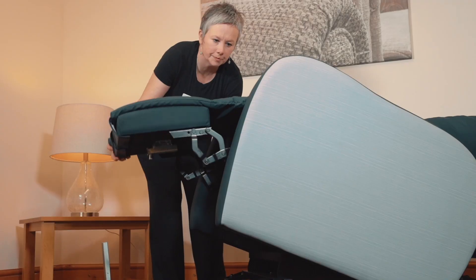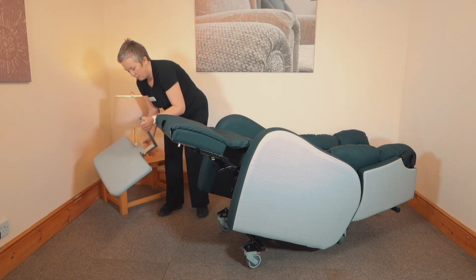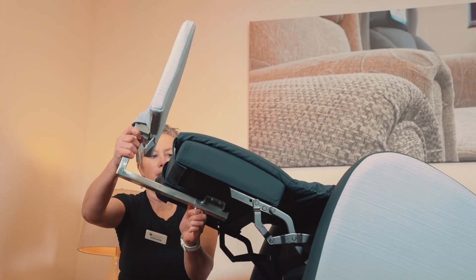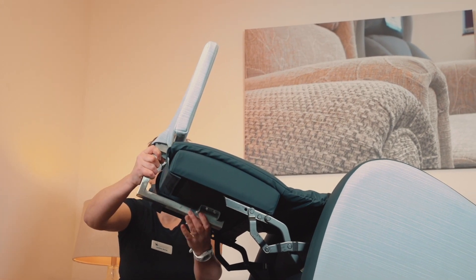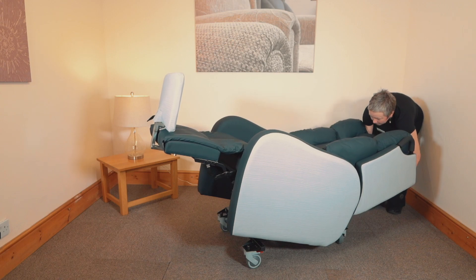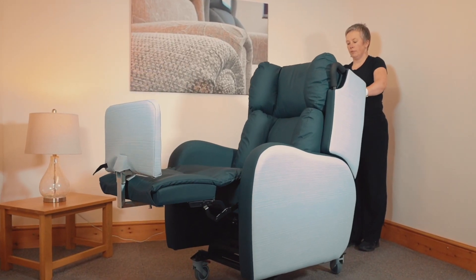The Boston provides carers with a number of options to enable regular repositioning of users to redistribute pressure and provide all-day comfort. It comes with a unique combination of tilting space and independently controlled back recline and leg elevation.